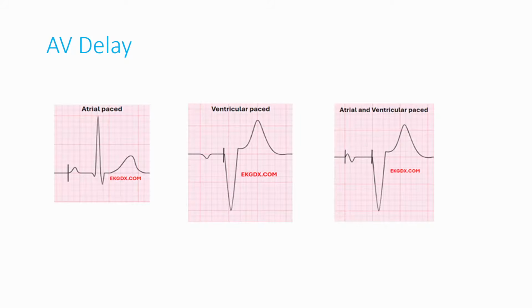But if the patient has his own PR interval, that's what he's trying to say. If he's got 150, you could try to keep it at 170 so that the patient's own QRS comes before the paced QRS does. You can save battery life. You allow for the filling to happen. That's what it means by playing with the PR interval. You see what that patient's PR interval is, program it to that. That's why it's called optimization.